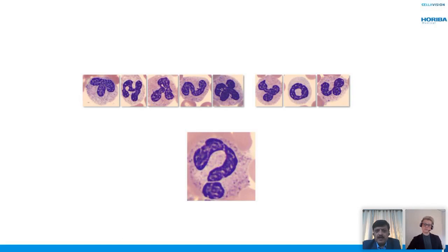So generally, yes, the DM series and the DI series will require the cut-edge slides that come out of the slide maker stainers, but the DC1 is developed for more mid-size labs and small-size labs, so you would then maybe not have the slide maker stainer, so you can still use the regular slides.